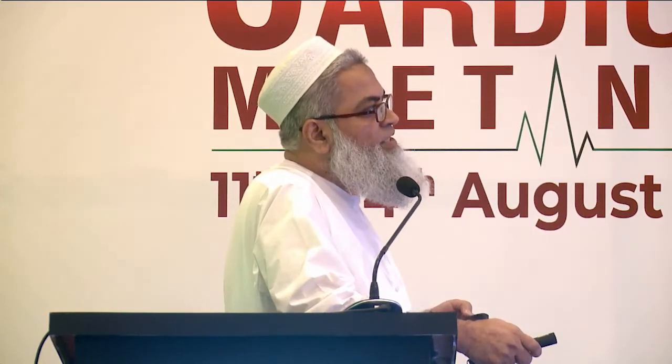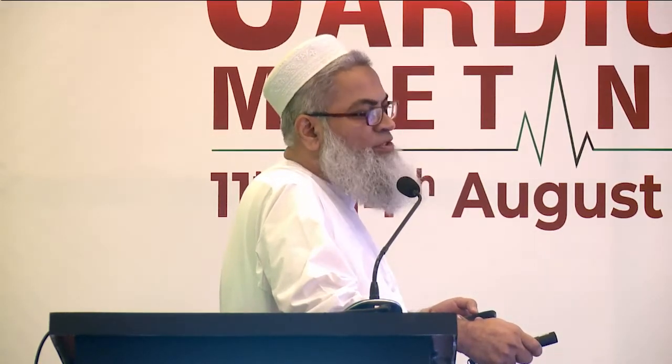So before we proceed to the steps, we need to know the tools, and you will be able to manipulate and see all of these tools. They are behind at the table. So there are three basic things. Mullins sheath, usually it's an 8 French sheath, which has got 59 centimeter length, and then we have got this dilator of the Mullins sheath, and at no point will you withdraw this dilator, because this dilator is going to occupy this needle inside, and this is for the protection so that it will not puncture the septum and this sheath and come out of the system.